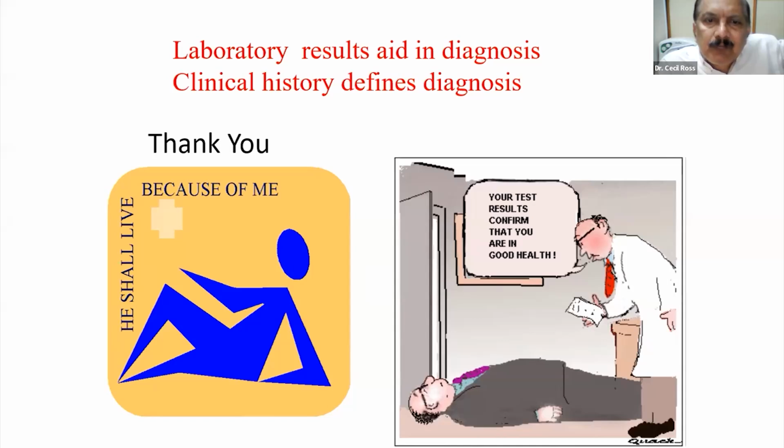Precautions in sending factor 8 inhibitor levels. Yeah, so this would be a single draw of blood by clean venipuncture in the blue top tube, with the correct 9:1 ratio, and send it immediately, and they will process the test. Right.